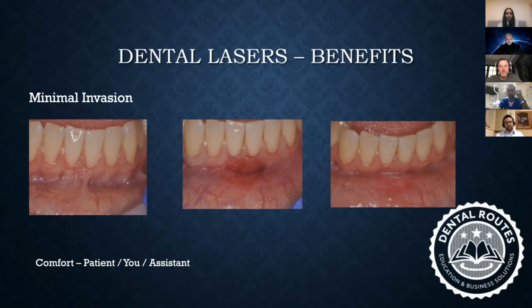So if, for instance, imagine that tooth was an implant tooth, which it is not here, and then you have a high frenal attachment, 10 minutes, you would have just cleaned up all the muscle fibers out there. The bleeding is so minimal. 1 week later, this is the healing. You can even actually see the amount of growth that the gingiva has already achieved around that tooth up there.